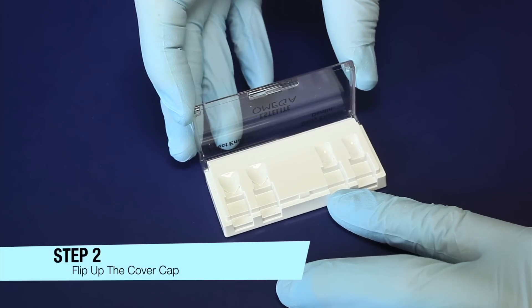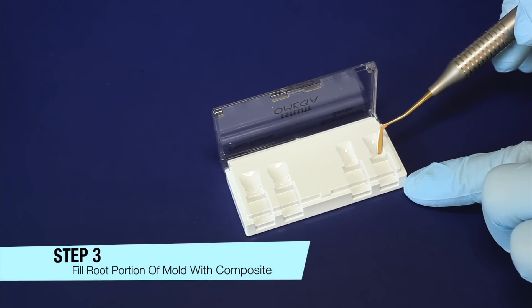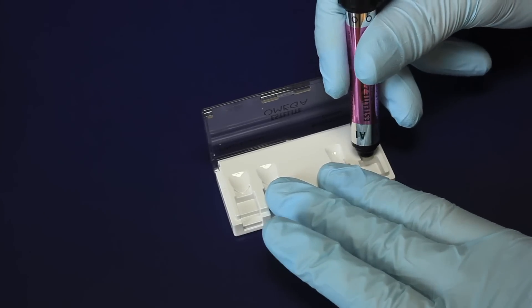Step 2: Flip up the cover cap of the mold. Step 3: Before setting the shade guide handle into the appropriate slot, fill the root portion of the tooth-shaped mold with composite.